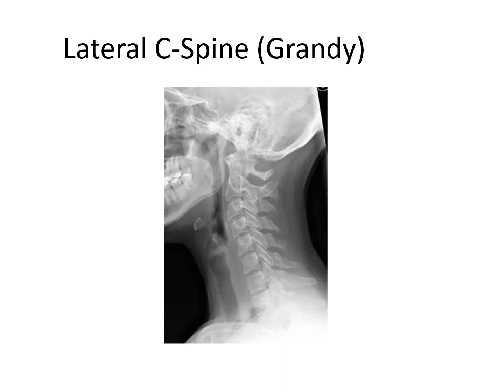Okay. Now we can actually count vertebral bodies here. We have an air-filled trachea, we have a hyoid bone, a larynx. Okay. Looks like the epiglottis is partially down. They might have been in the midst of swallowing while this radiograph was made, because it looks like the epiglottis is partially down. There is an air-filled trachea. You can see the cartilage rings of the trachea down low there underneath the voice box.